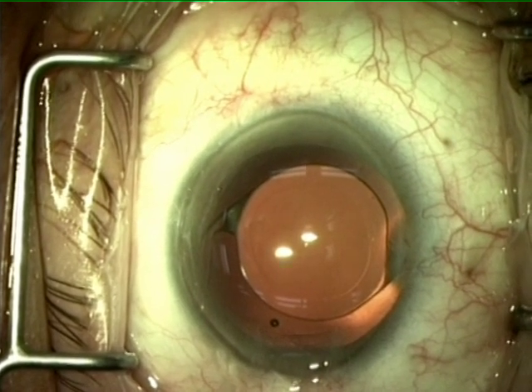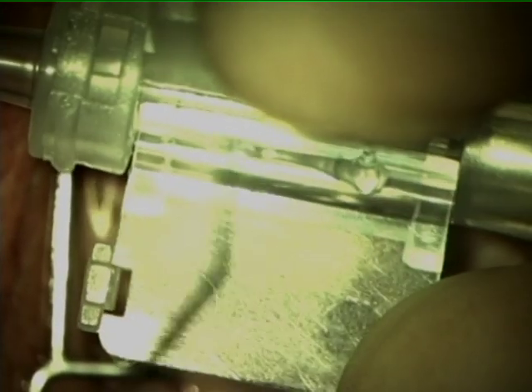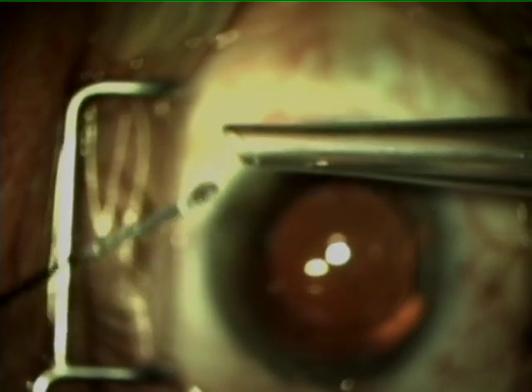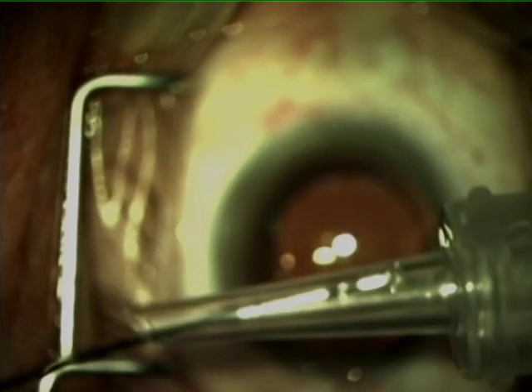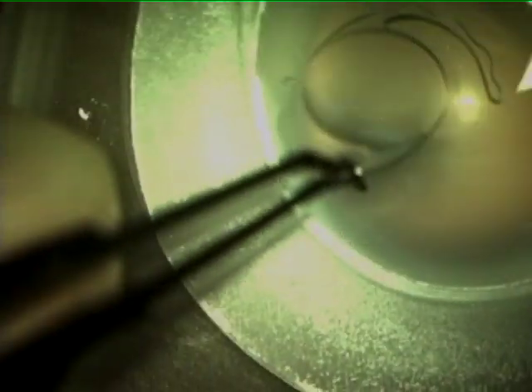First of all, a suitable viscoelastic, or OVD, is sparingly applied to the injector loading bay to lubricate and facilitate the injection process. The injector nozzle is also filled with a viscoelastic. Now we see the lens being lifted from the blister pack by a pair of non-serrated forceps, such as Kellman-McPherson's.